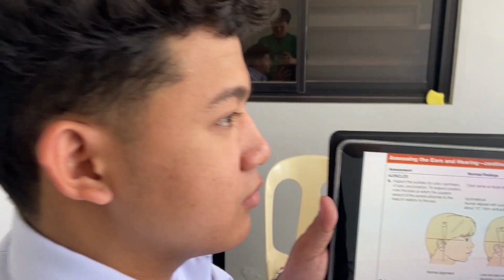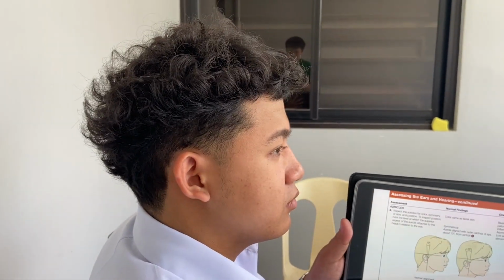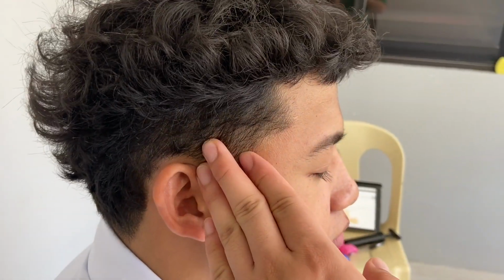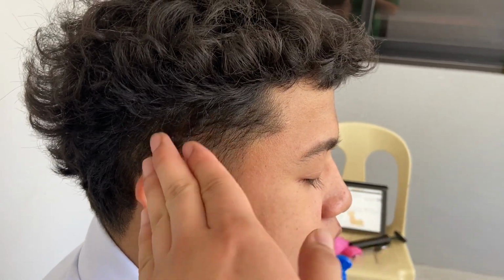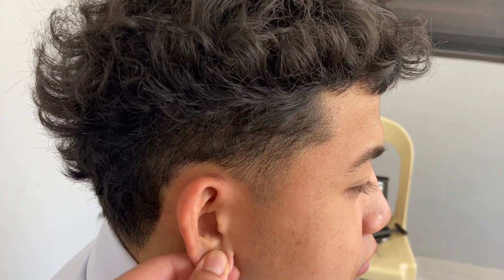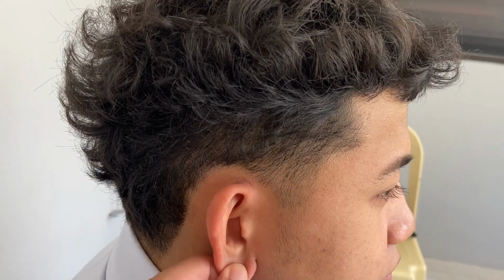Inspect the auricles for color, symmetry of size, and position. To inspect position, note the level at which the superior aspect of the auricle attaches to the head in relation to the eye. Palpate the auricles. Inspect the external ear. Visualize the tympanic membrane using an otoscope.